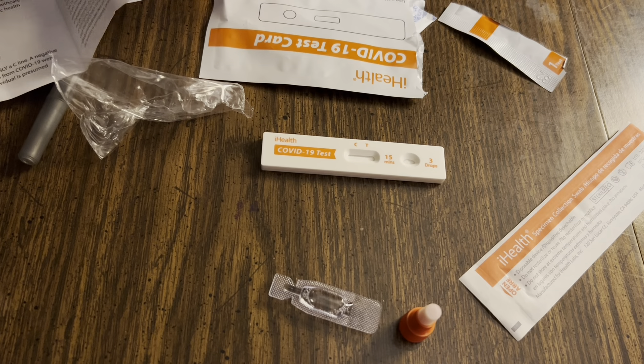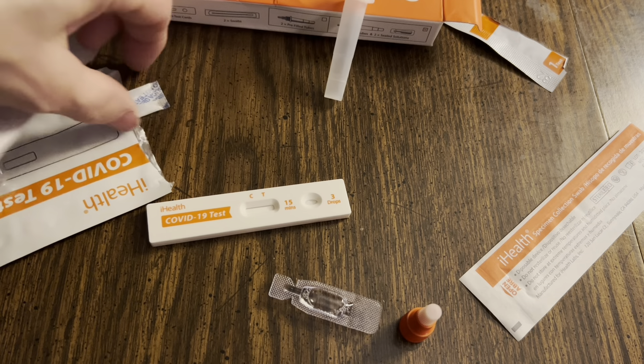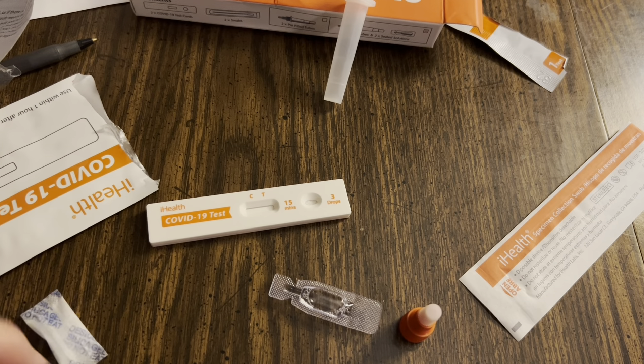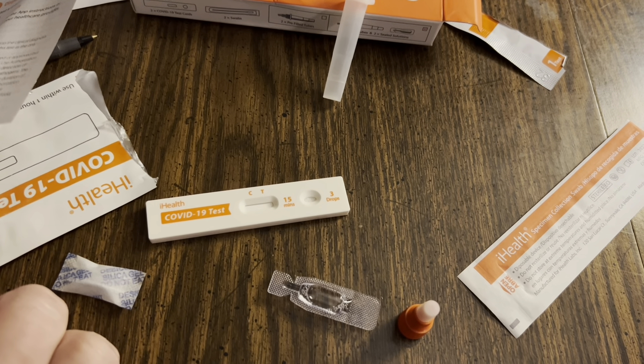You're going to want the tube to stand up at some point, but it's not doing a great job, so I'm going to use the box to brace it up like that. There's a silica package — don't eat that. They always say do not eat.